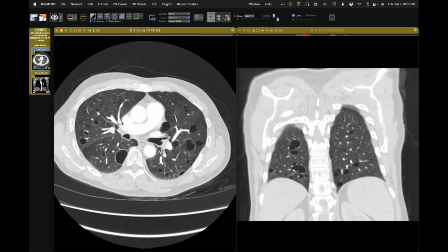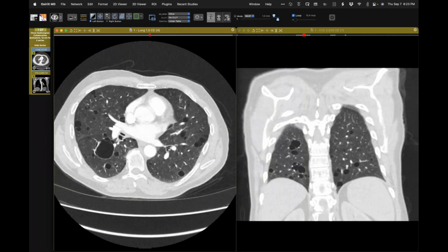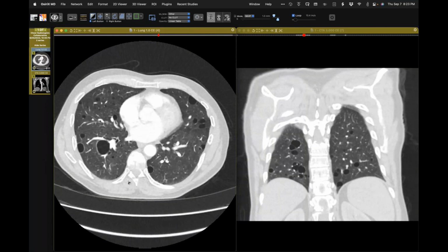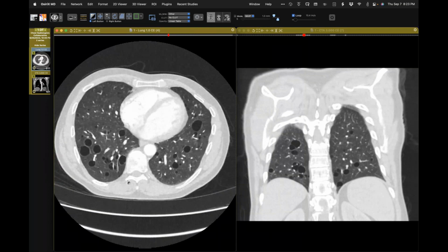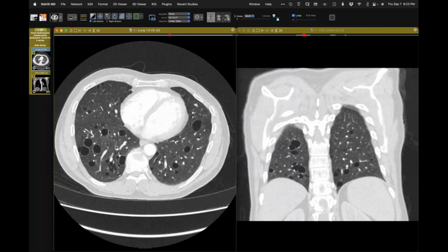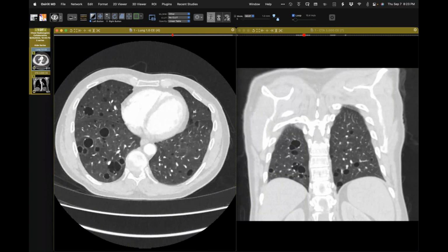The other thing to notice about this, and I'll show you a couple of places, is that there are septations within the cysts. So maybe we started with individual cysts that gathered together and became larger and multi-septated, and you can see that there too. You'll also notice in quite a few locations that vessels traverse quite easily, in multiple locations completely traversing some of these cysts. Of course, some vessels are around the cysts and not pushed apart, but some clearly go right through and traverse these cystic spaces. And that is, I think, a very helpful feature. So septated, a lot of them, and the vessels going through there.